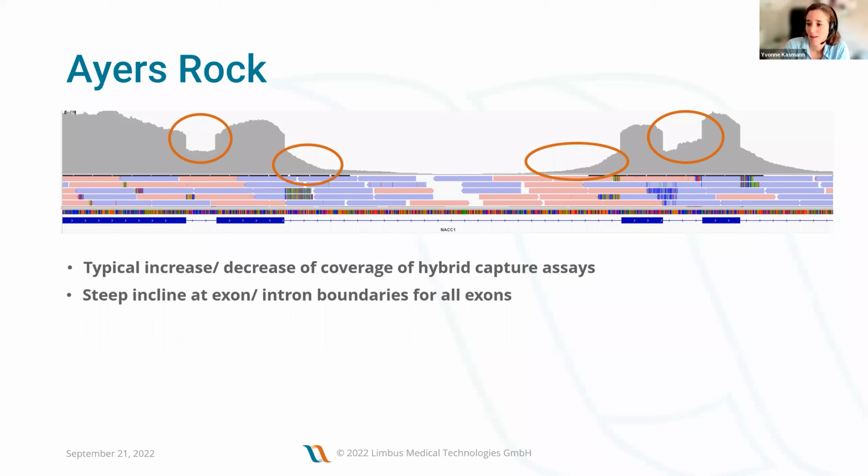But most customers choose our archive service, where we also store the raw data, the BAM files. The advantage of the storage is that the coverage information is always accessible from Varvis. So even if you open samples that were processed a year ago, and you open IGV, you will still be able to load the BAM files and see the reads again. If we delete the BAM files from our system, this is the link that you will lose.